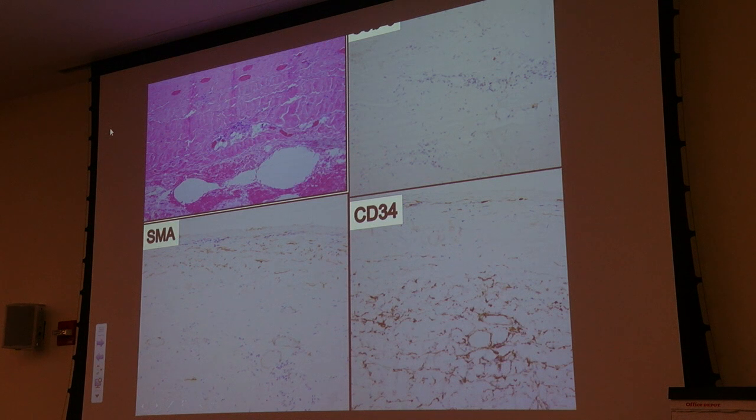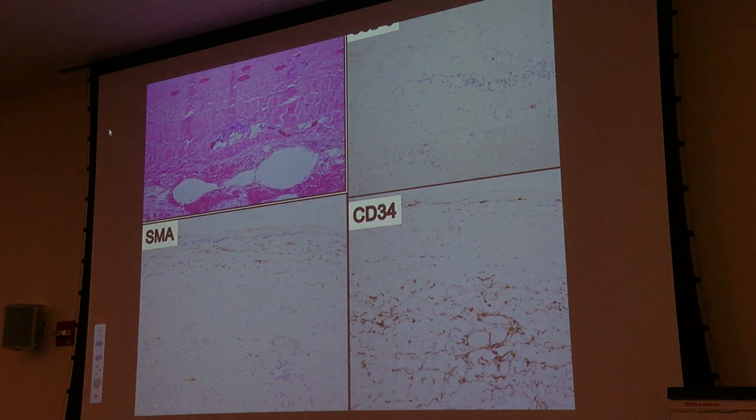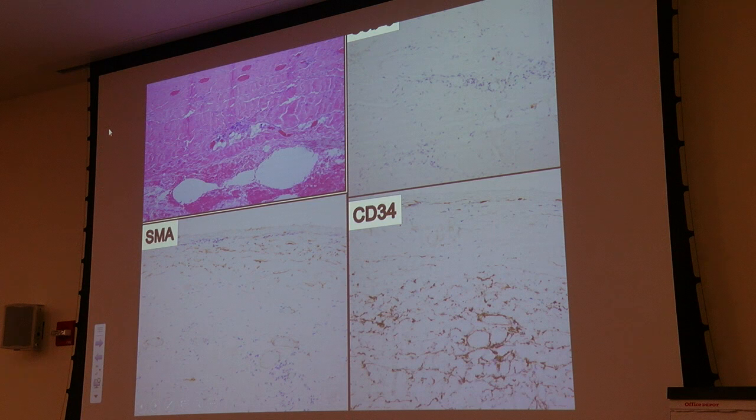Now this is Ernie's pericardial biopsy, showing the striking hyalinizing fibrosis looking very much like scleroderma. So I wanted to understand if in fact the spindled cells had a scleroderma phenotype. The fibroblasts in scleroderma typically elaborate smooth muscle actin and do not show CD34 staining. And right in this zone of smooth muscle actin staining, the CD34 is absent.